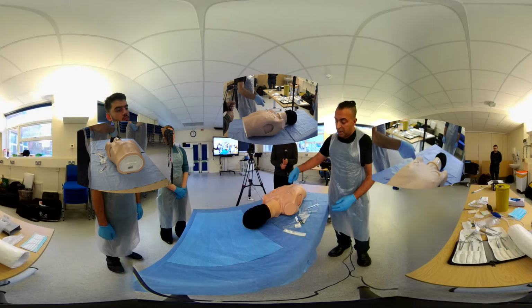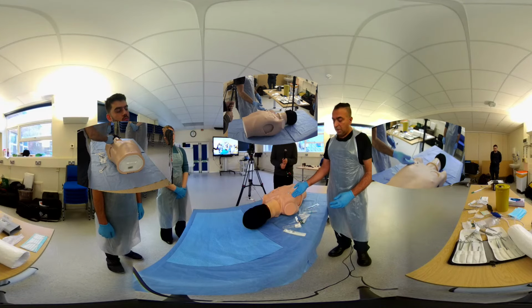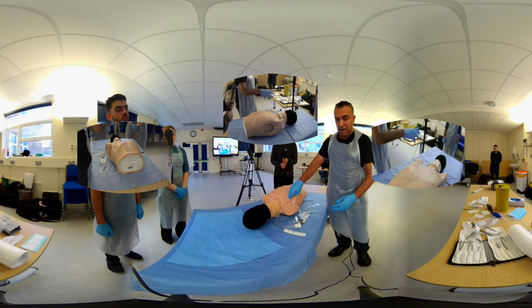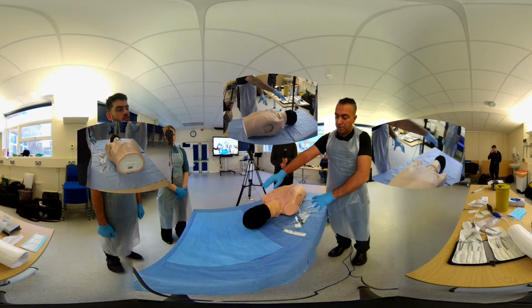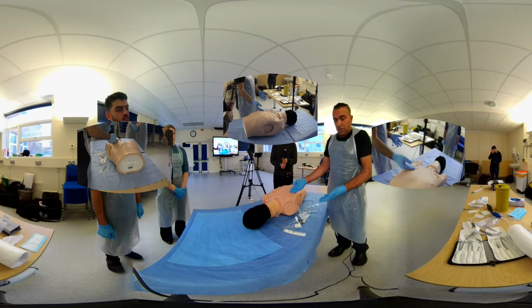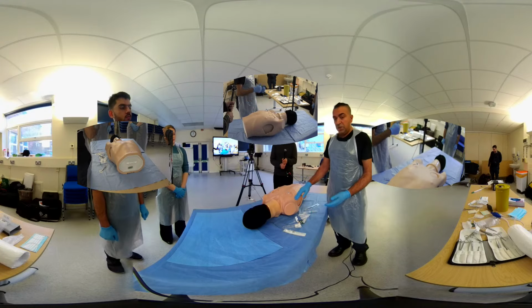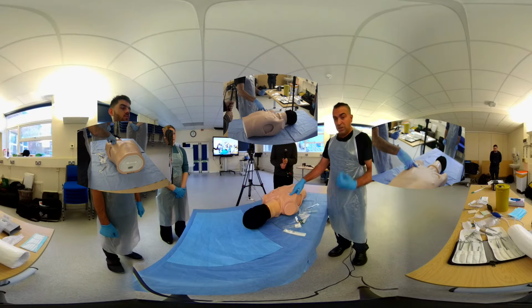So you may only just be in, and if you come out of it a little bit, then you're going to develop surgical emphysema. So surgical emphysema can be pretty impressive. All of this would be bubbly and crackly like a packet of crisps. All of this would rapidly expand, go up into the chest, into the face side, and you'll then lose this. So then this will be not working. The patient's tension pneumothorax will be back again. So essentially, you're back to square one.